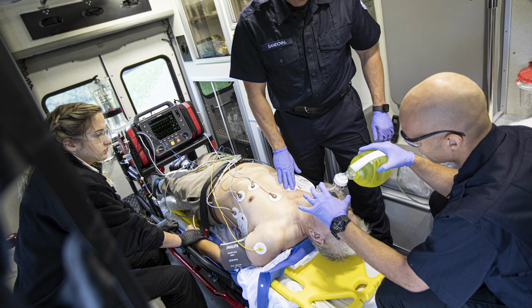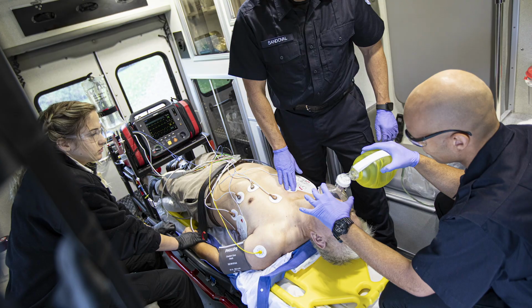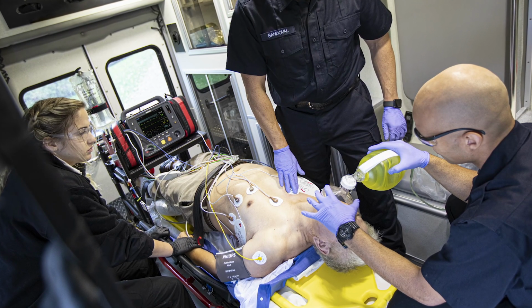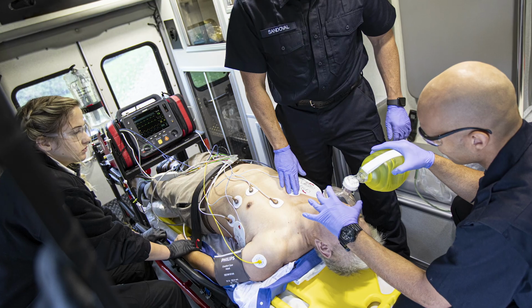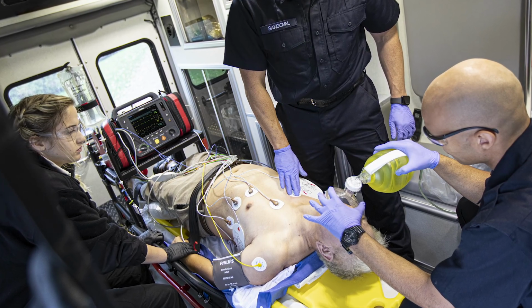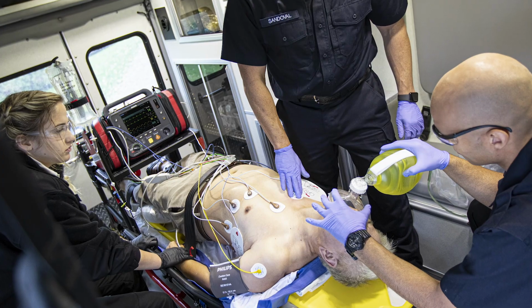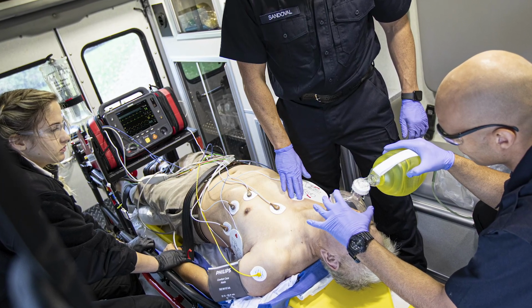The HeartStart Intrepid offers an optional 12-lead ECG function using Philips' DXL 12-lead algorithm that is available in monitor mode and allows you to preview, acquire, print, copy, and store a 12-lead ECG.